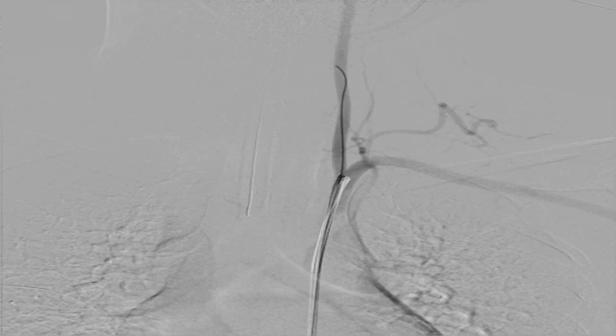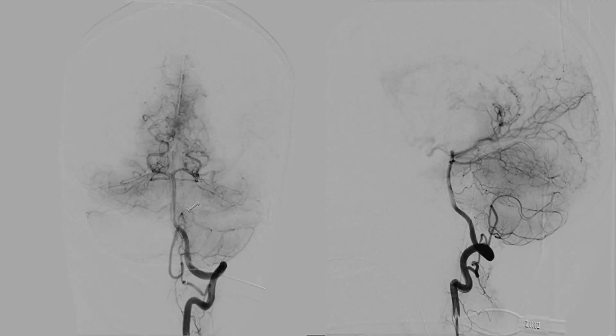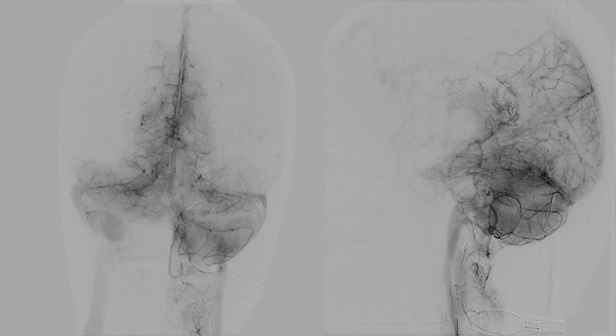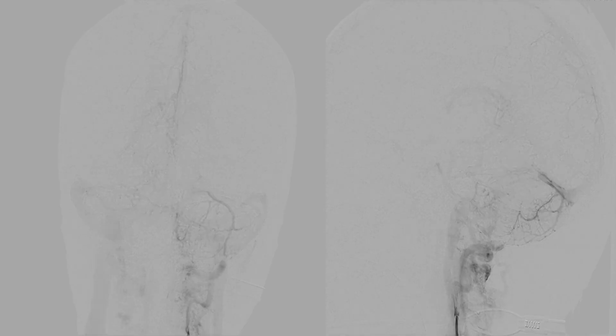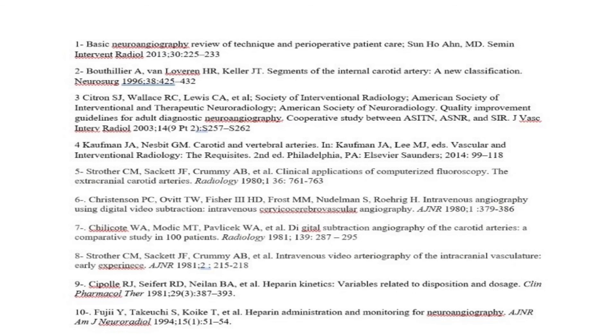For the left vertebral artery, we withdraw the catheter slowly with the tip facing the left side — it automatically hooks the left subclavian artery. We advance the wire into the left vertebral artery, pass the catheter over it, and take a biplane DSA.